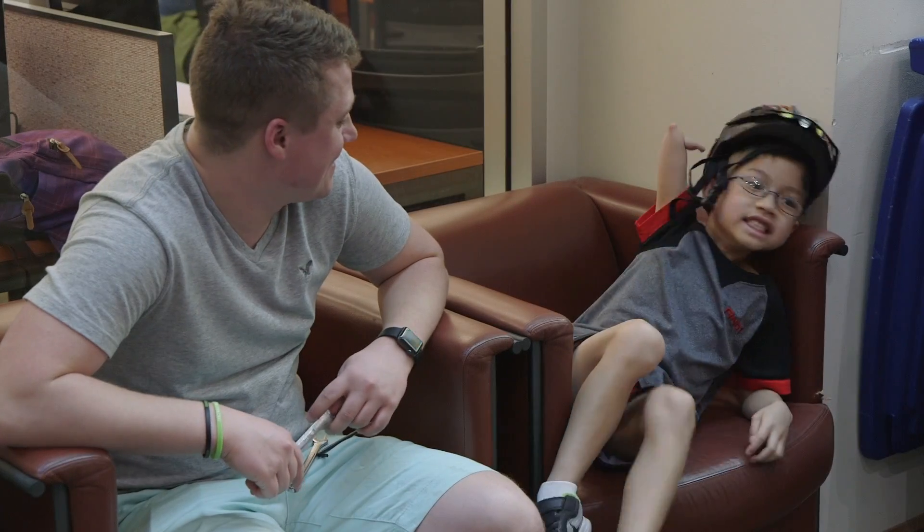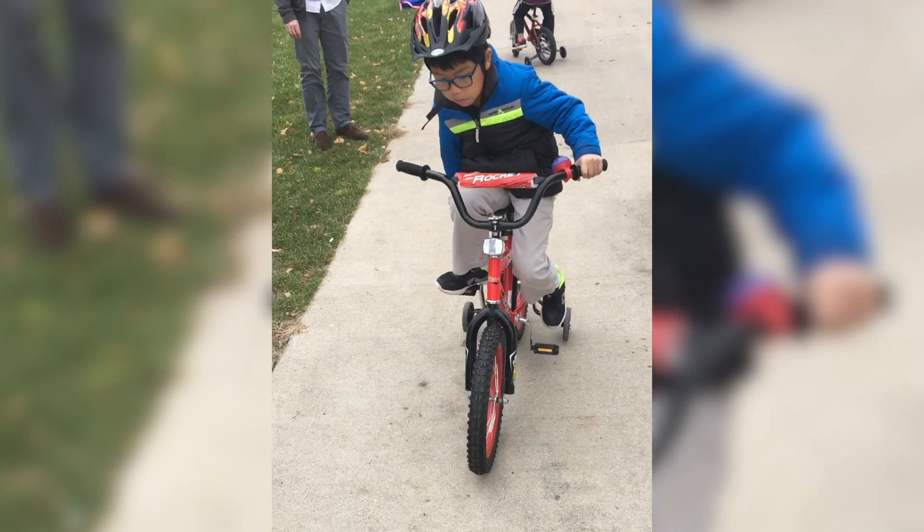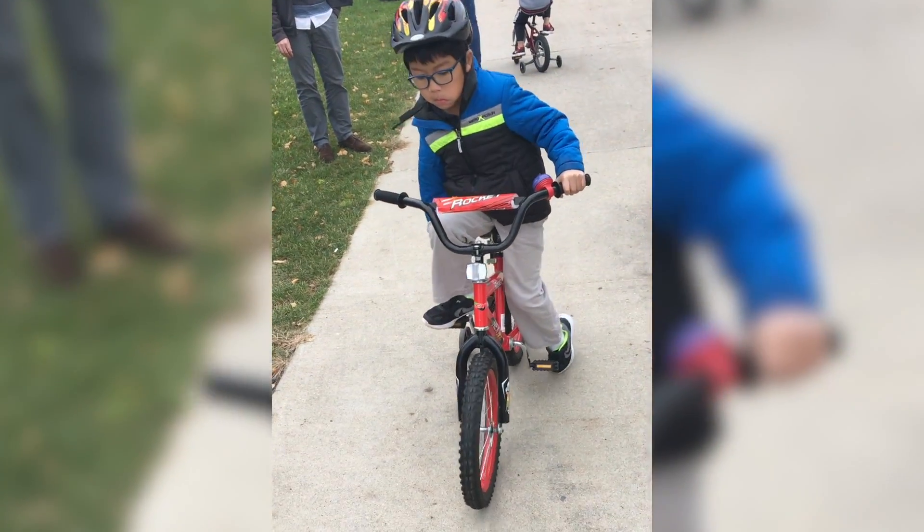So we made this device for Johnny Cole. He's eight years old and had a congenital arm amputation. He really struggled with riding his bike, so that's where we came to this device.